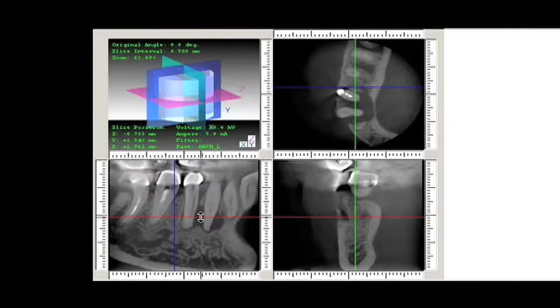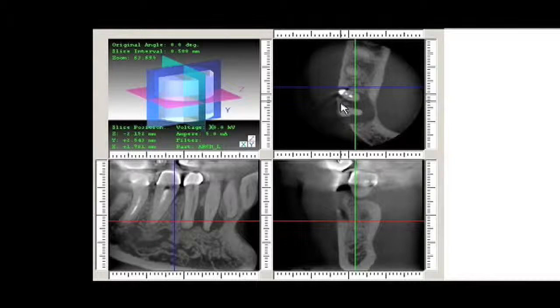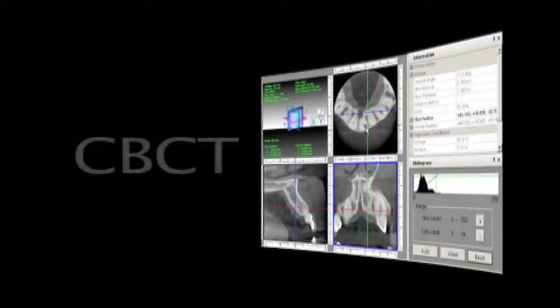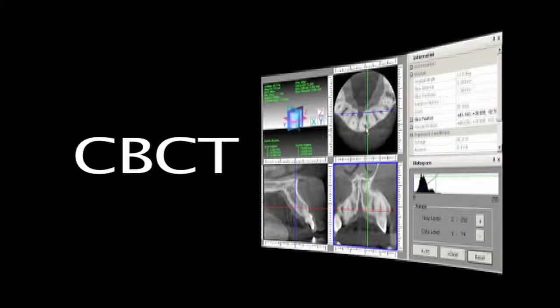However, when we travel through the coronal-apical plane using the horizontal red bar, we clearly observe a lingual fracture on the second bicuspid. The CBCT gives us the tools to examine the teeth and supporting structures in three planes. In the case of the lower bicuspid, the buccolingual views gave the impression of a missed canal. When viewed coronal-apically, however, we clearly saw a vertical fracture.